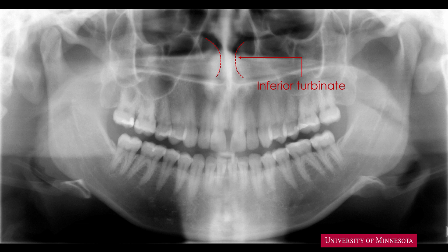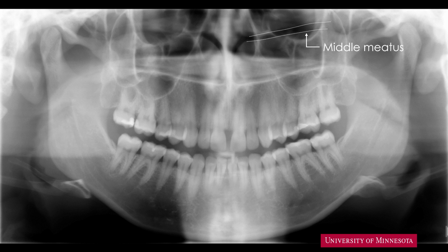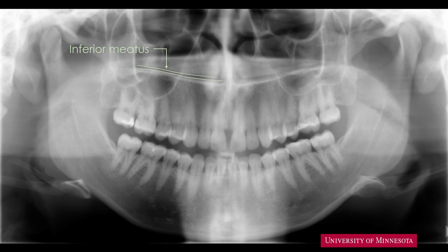If we trace from the common nasal meatus, we can find a radiolucent band, almost horizontal, extending distally. This radiolucent band superimposes over the inferior part of the orbit — this is the middle meatus. On the inferior part of the inferior turbinates, we can see another horizontal radiolucent band. I am showing you the right side of the inferior meatus; please identify the left inferior meatus.